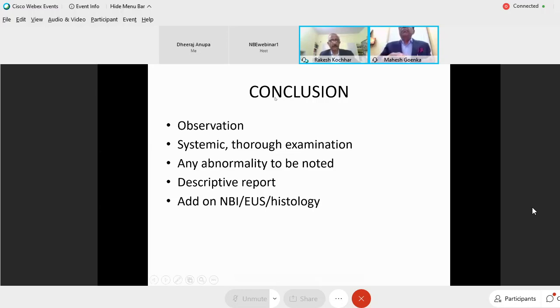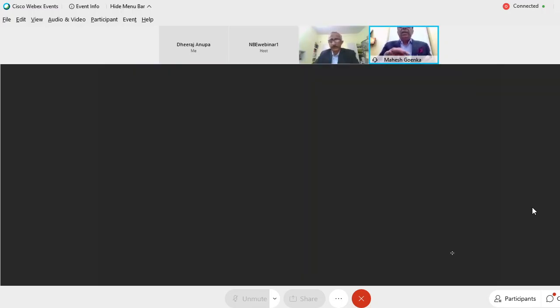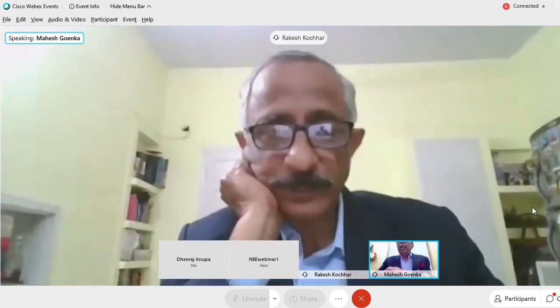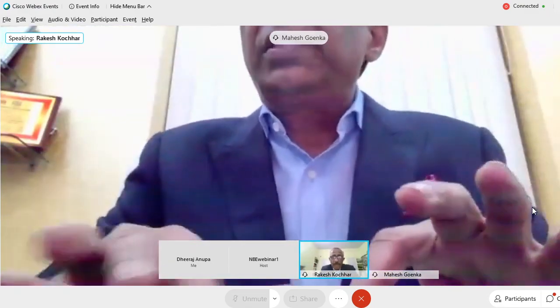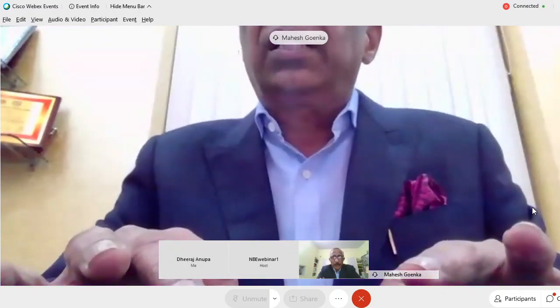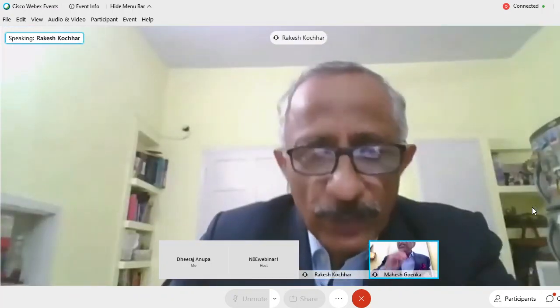So thank you for this wonderful atlas of upper GI endoscopy which you have shown us. Almost complete coverage of all the upper GI lesions, but that also means that we would have to have another class later on about the rest of the GI tract. Now, there are a couple of questions. How can we differentiate D2 from D3 endoscopically? I mean, when do you say it's D2 and when do you say D3? Can you see the question from the chat box there, sir? Otherwise, I'll tell you that you can read it.